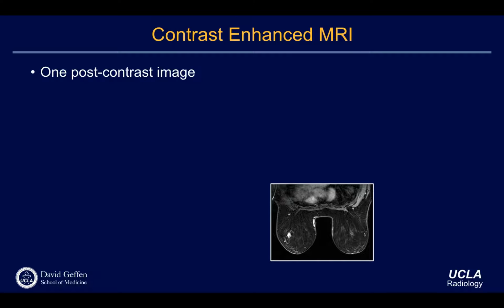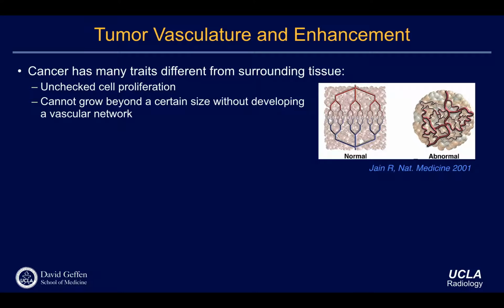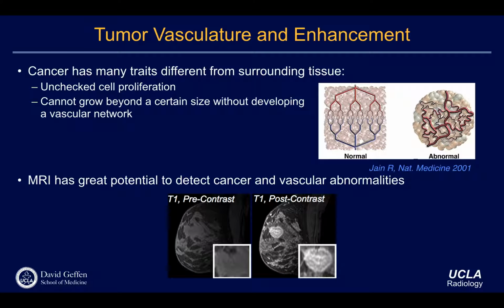I really like the question, because you asked why it's brighter. There's probably 11 reasons it's brighter. We only touched on a couple. The other one I would add has to do with where the contrast agent is present. You administer the contrast agent to a patient in a vein, and you're going to probably get into this, but if it shows up brighter, it means there's more contrast agent in that specific location.